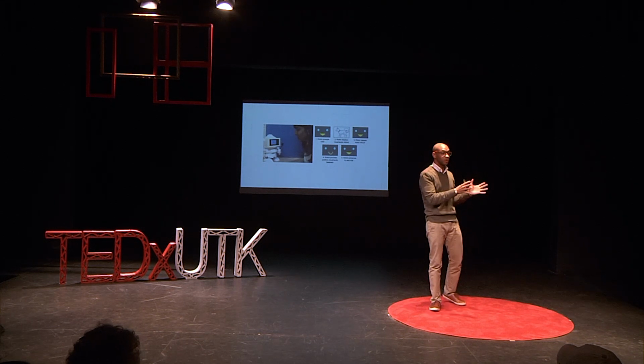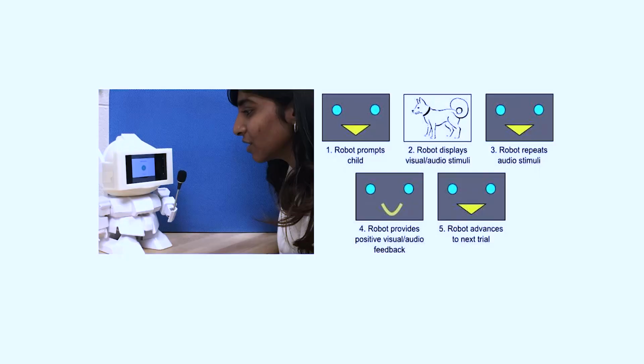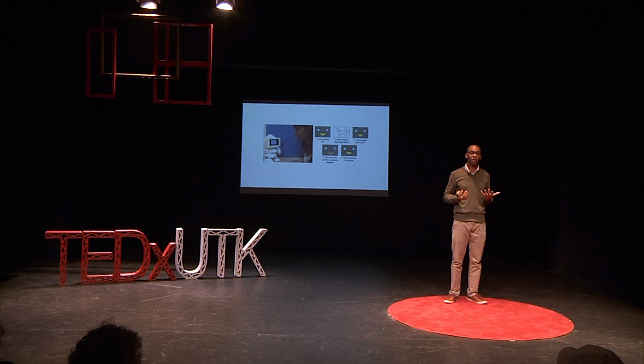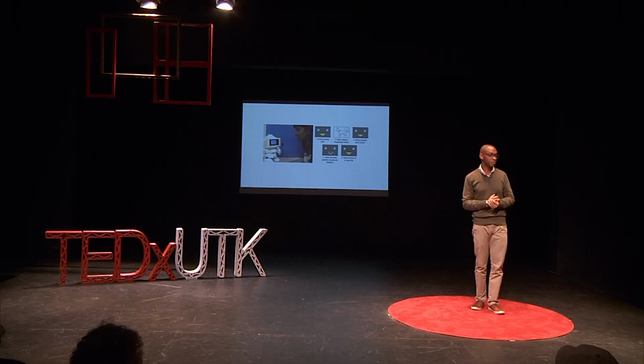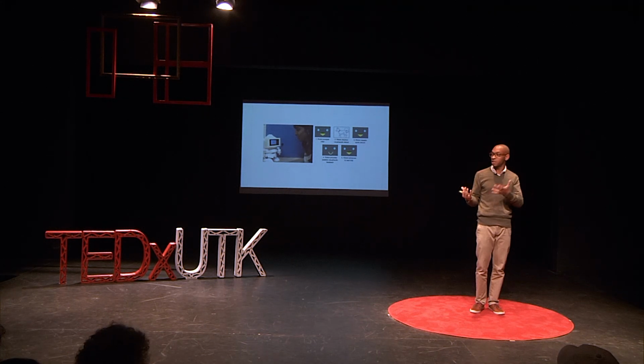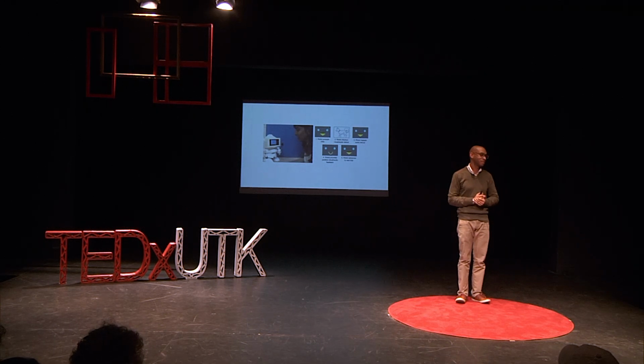But functionally, what did we do? We took an off-the-shelf robot, which is basically designed as a toy. We 3D printed the head. So I think most of us are familiar with 3D printing. But for those of you not familiar, 3D printing is a process whereby you build a three-dimensional object in software, you send it to a printer, and it constructs it out of plastic or metal or some other material. But we 3D printed a head, and we took the phone, and one of the individuals in the program is actually sitting in the room today, so I'm glad he made it.